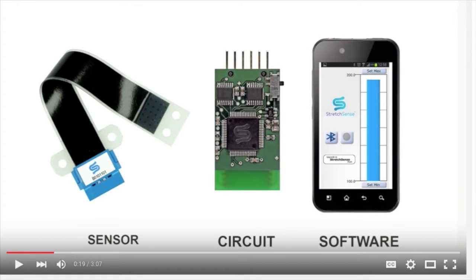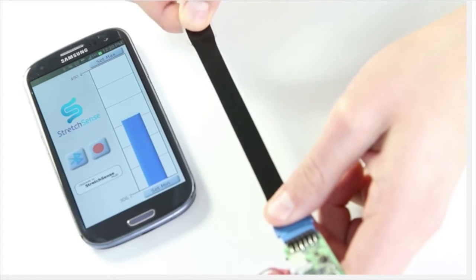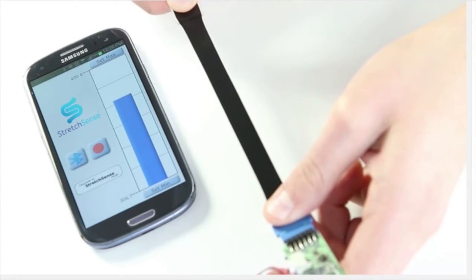I want to finish with discussing an emerging technology in the biomechanics and orthotics space. How would you like to be able to obtain an indirect measure of arch deformation or change in arch bend or pressure in footwear and with foot orthoses? Well, this technology has already arrived.